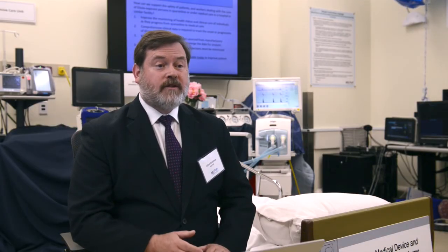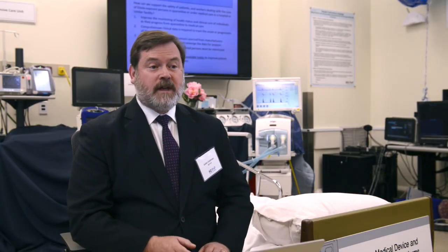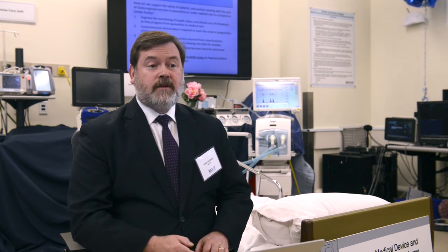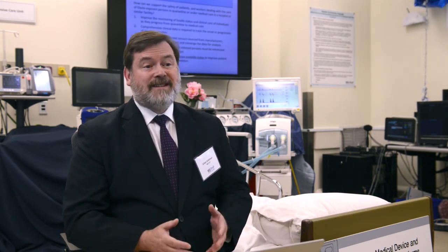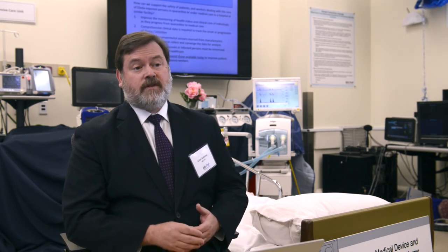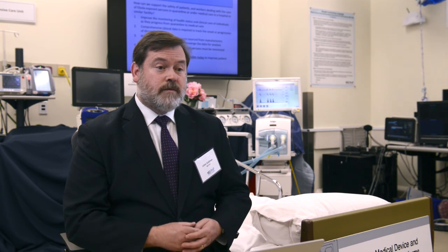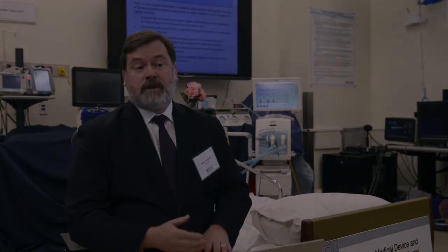If we could avoid entering the patient's room unnecessarily, we could reduce the exposure of healthcare personnel to Ebola virus and other infectious diseases, and also we could more rapidly respond to patient needs, because it can take anywhere from 5 to 15 minutes to properly put on the protective gear before entering the patient's room, and an equally long time to properly remove the gear.